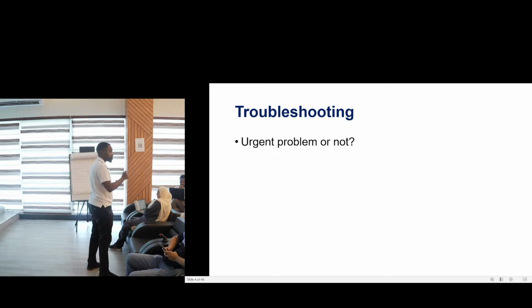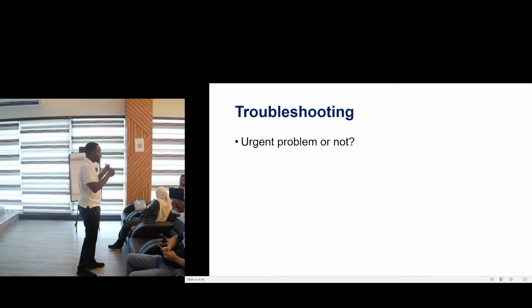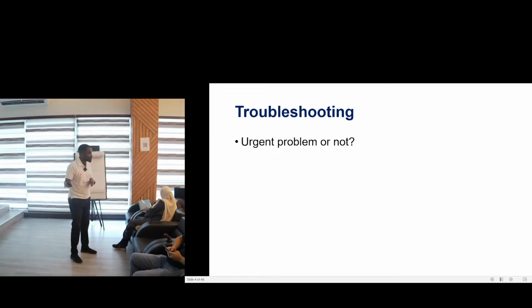Because you will find your patient in distress on a ventilator, there's no alarm, and is saturating very fine. You understand what I'm saying? But you, with your clinical acumen, by observing your patient, will know that this patient is in distress and something is wrong here. You need to solve it. But if you rely on the monitors and alarms, you will pass through, the ventilator is okay, the monitor is okay, and you will leave.